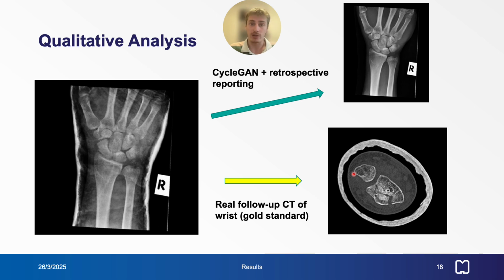In the other report with a diagnosis that differed, one radiologist found that linear lucency through the distal radius may represent a non-displaced fracture, although assessment is suboptimal. In this case, the other 2 radiologists wrote no fracture, as was determined in follow-up CT imaging. Now, the ability of radiologists to perform robust reporting with downsampled AI-enhanced images is clinically meaningful and warrants further investigation.